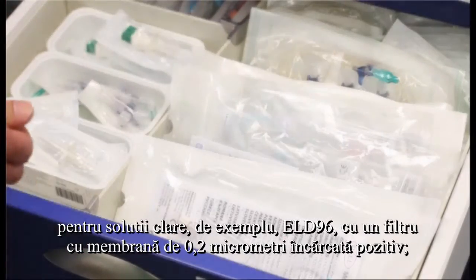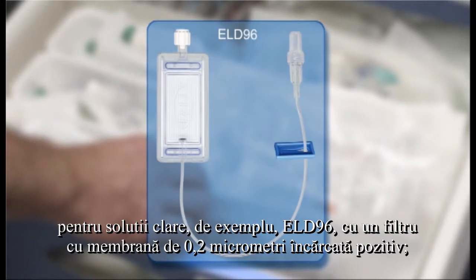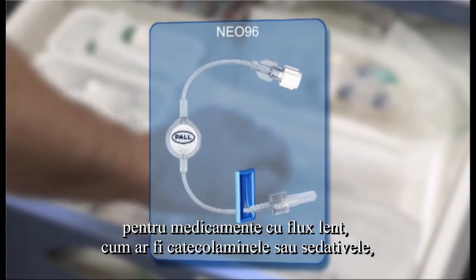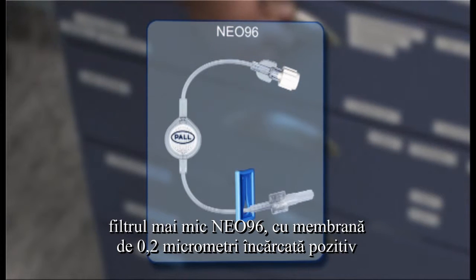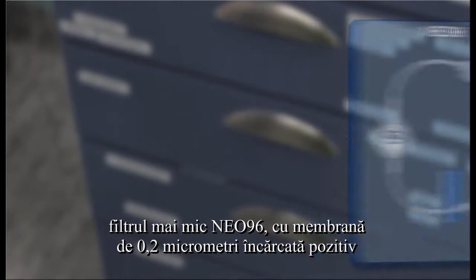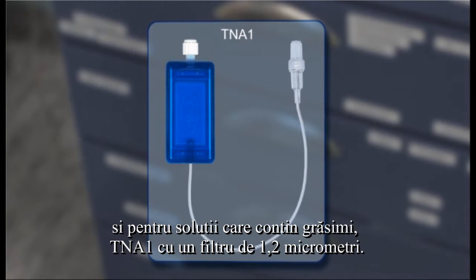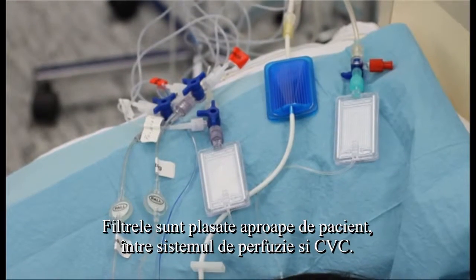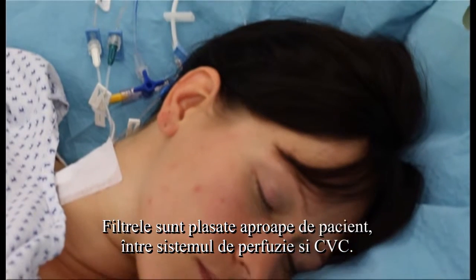For crystalline solutions, for example, the ELD96 with a 0.2 micrometer positively charged filter membrane. For drugs with low flow rates, such as catecholamines or sedatives, the smaller Neo96 filter with a 0.2 micrometer positively charged filter membrane, and for solutions containing fats, the TNA1 with a 1.2 micrometer filter membrane. Filters are placed close to the patient, between the infusion system and the CVC.